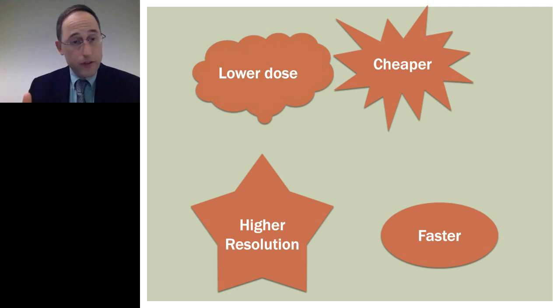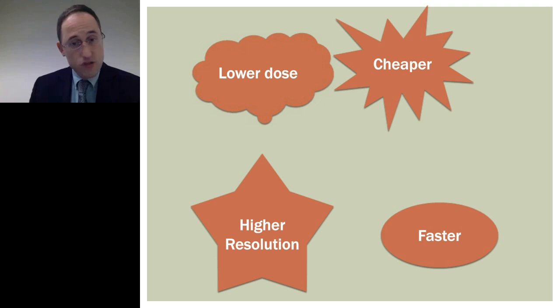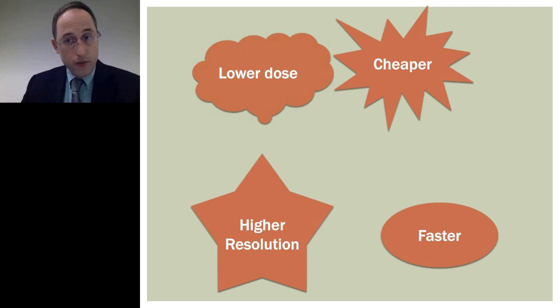And I feel very strongly about that. So tomosynthesis is a lower dose. It is cheaper, higher resolution, faster, and so it sounds fantastic. And so the question is then, when should it be used?